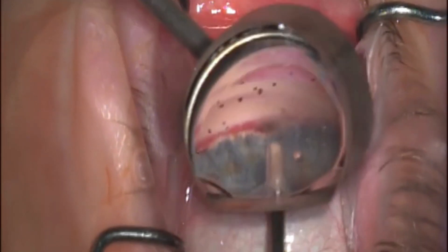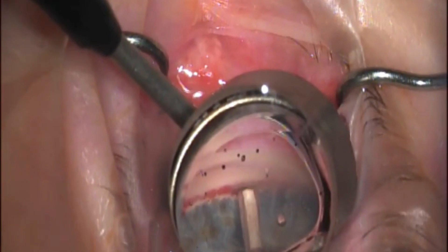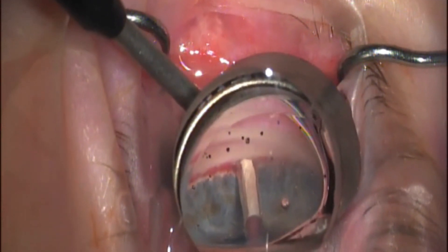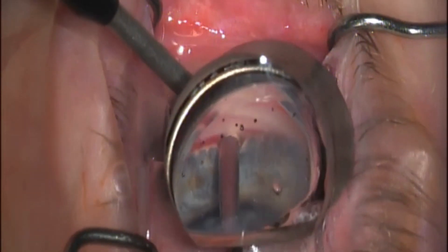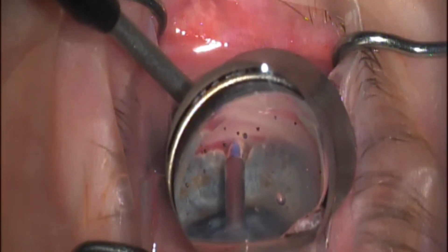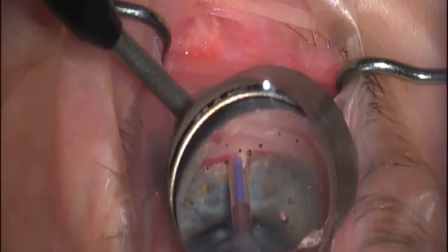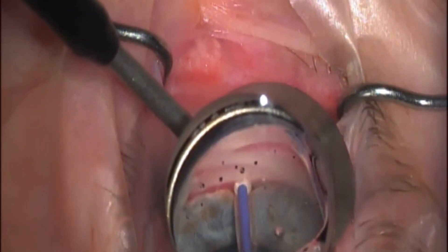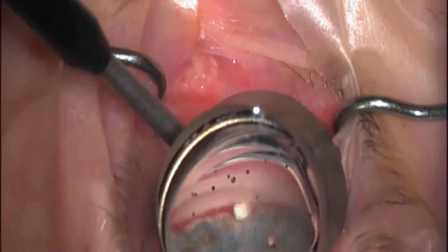This is that scleral tissue wrapped around that plastic sleeve. I'm going to bury that plastic sleeve completely into our supraciliary space like you can see here. Once it's completely in, I'm then able to depress the button — this does not advance the prolene so much as it just retracts the sleeve and holds the scleral tissue in place.